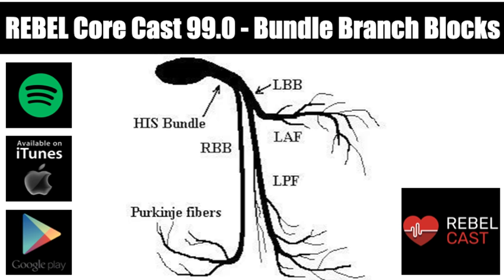Normally, the right bundle depolarizes the right ventricle. In a right bundle branch block, the right bundle doesn't activate. The right ventricle instead is depolarized by spread of the impulse from the left bundle through the left ventricle and then into the right ventricle. This aberrant electrical spread creates an aberrant QRS morphology. What we see on the ECG is different than normal because of the delay in conduction.